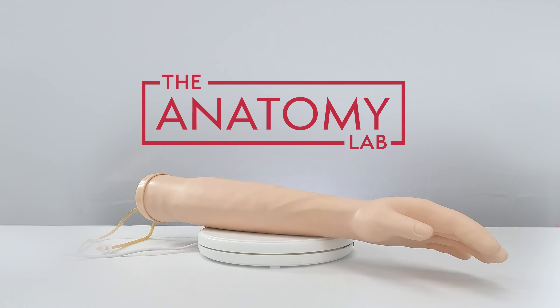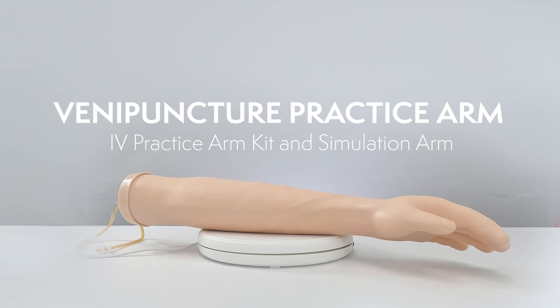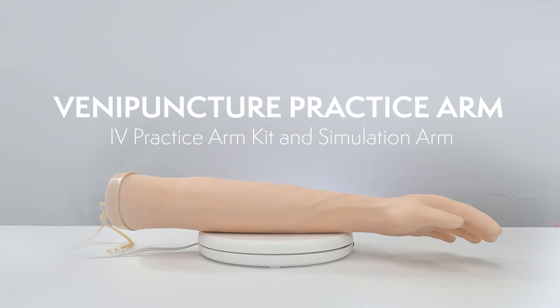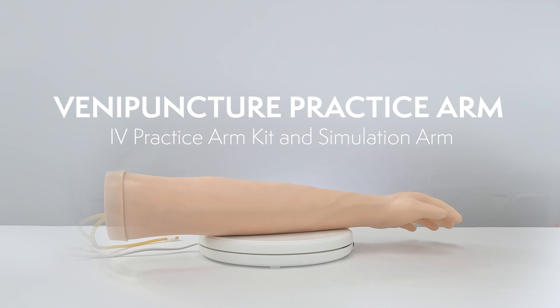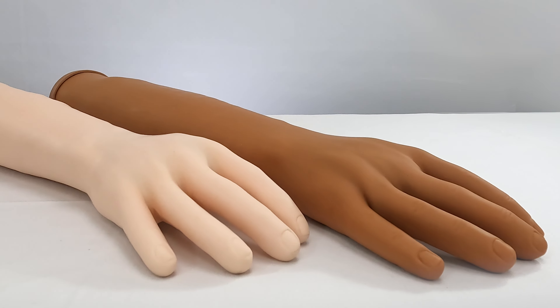The Anatomy Lab Venipuncture Practice Arm is an easy-to-use system for practicing both venous blood draws and IV catheter insertions, and is available in two skin tones: medium and light.